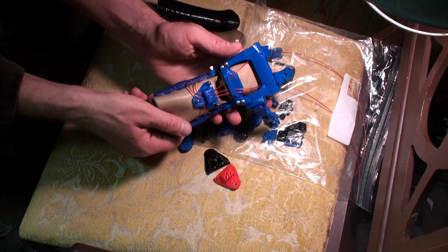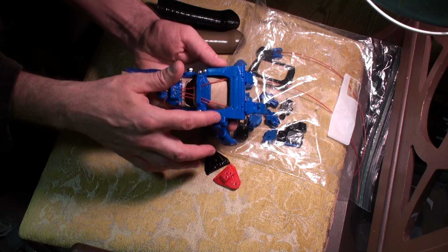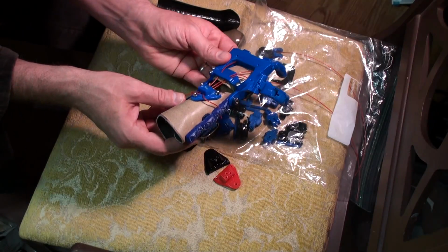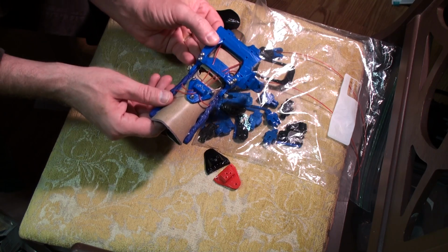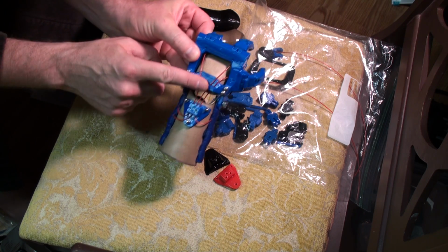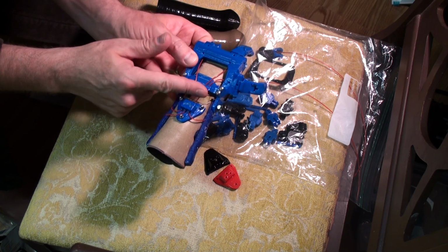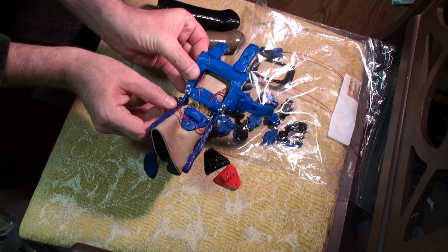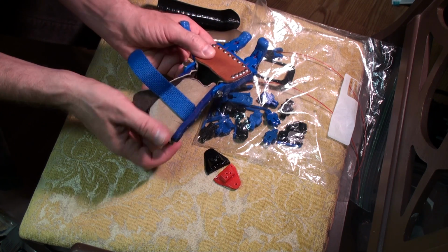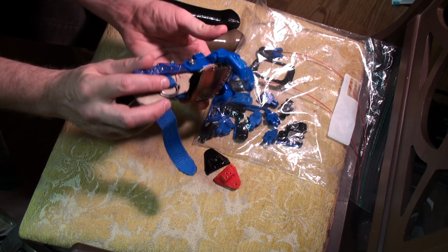And you'll see that this has no return system. The holes for the extensors are still open. They're not being used. So you could put an extensor system in if you wanted, but it's really not necessary with this because I've put the cable anchor close to the cable guide so that when the wrist extends, it actually pushes the cables and does manage to straighten the fingers just fine, which is great for somebody who is trying to develop strength, because it requires very little force to close the hand.